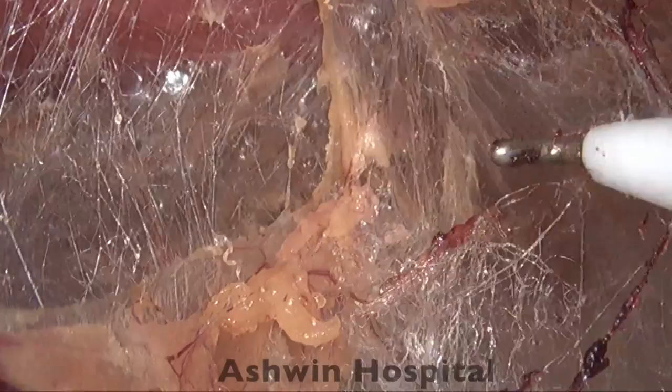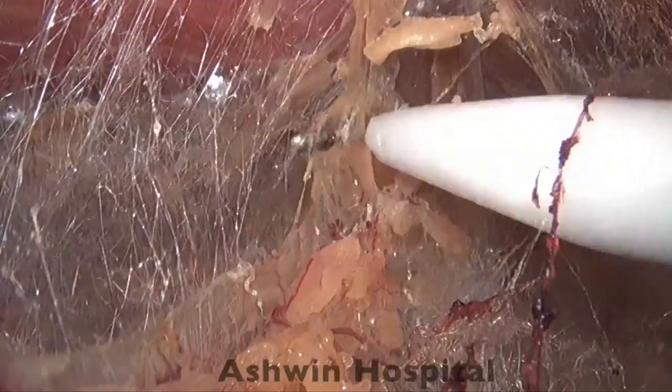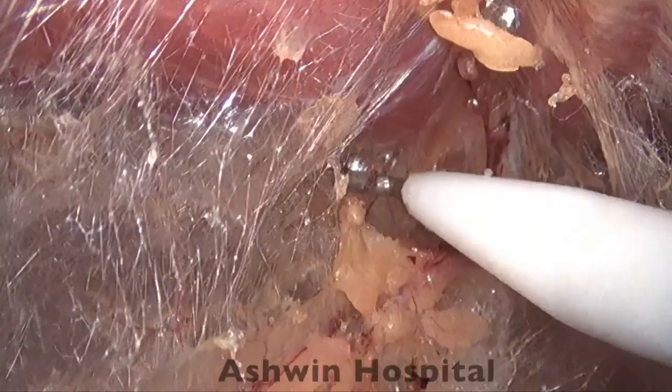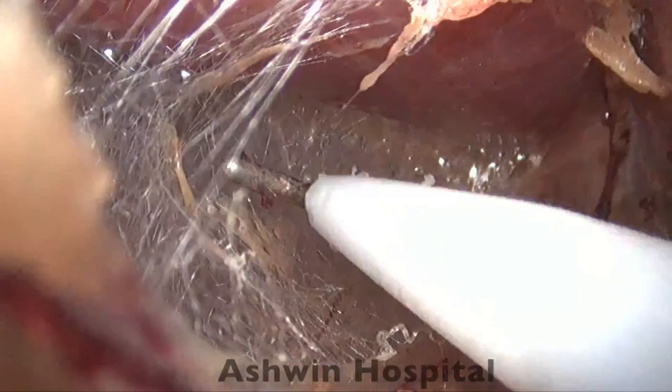So now you can see how the carbon dioxide is nicely opening up the planes and guiding us on the right way to carry our dissection. So we can continue in the same plane up to the Cooper's ligament, and we can see the structures very clearly. So now you can see how the loose areolar plane is on the left retrorectus space.